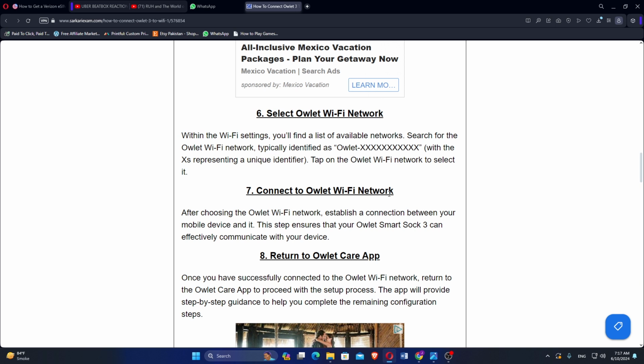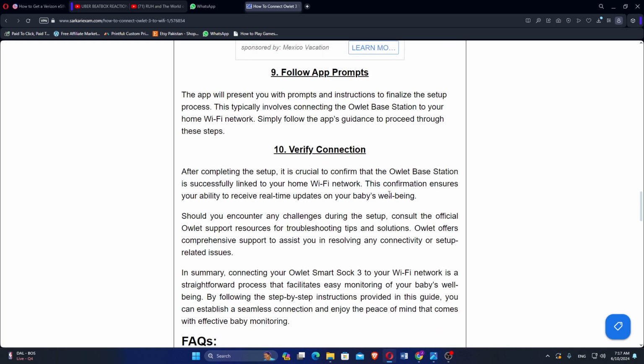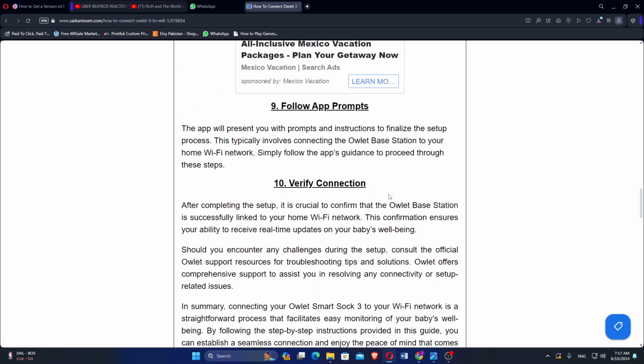Once you have successfully connected to the Owlet Wi-Fi network, return to the Owlet Care app to proceed with the setup process. The app will provide step-by-step guidance to help you complete the remaining configuration. The app will present you with prompts and instructions to finalize the setup process. This typically involves connecting the Owlet base station to your home Wi-Fi network. Simply follow the app's guidance to proceed through these steps.